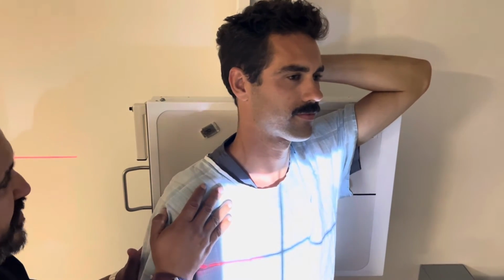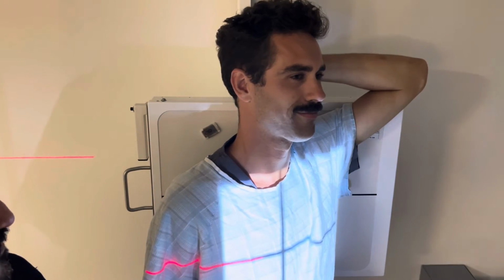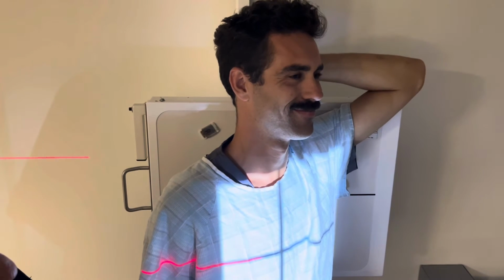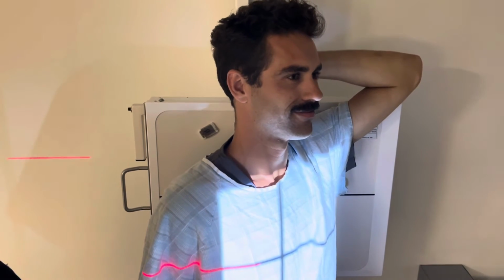He's at 45 degrees. I got the technique set at 12.5 mAs, maybe 15 mAs, if that. And we got about 74 kV. All right. So again, I'm going to have you breathe in. You're going to let it out. You're going to breathe in again, and you're going to hold it. All right, x-ray cleared, beep.